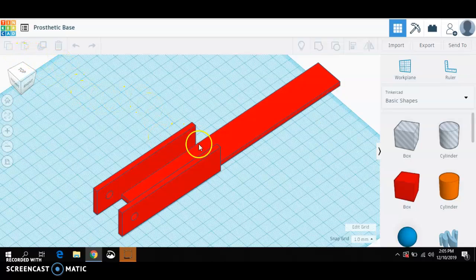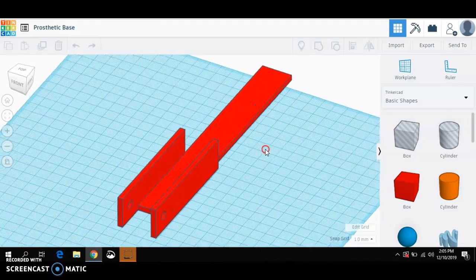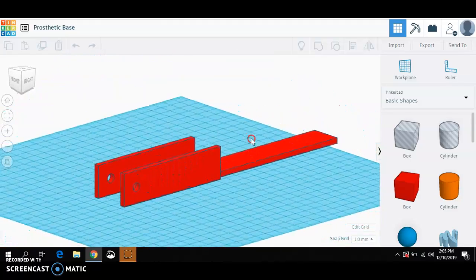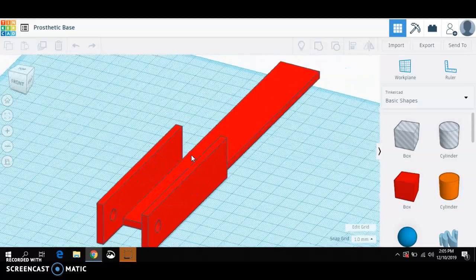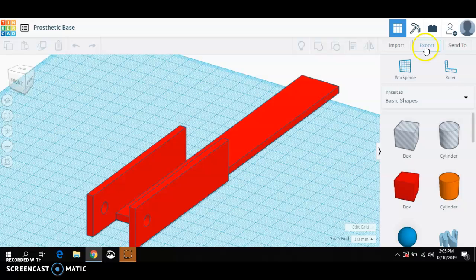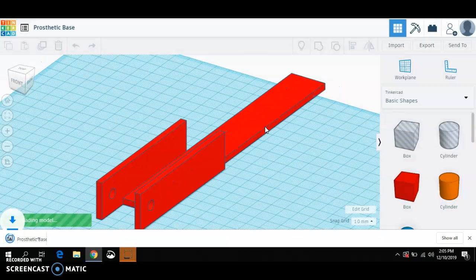Hi, this video is to show how to get a 3D model from Tinkercad to Cura slicing software for 3D printing. So when you're done with your model, you're modeling in Tinkercad, you simply export. In this case, there's only one solid object in the model, so it's going to be everything in the design. You can also, if you have more than one object, notice that we clicked STL. STL is just a solid object file, and we see it here in our downloads.